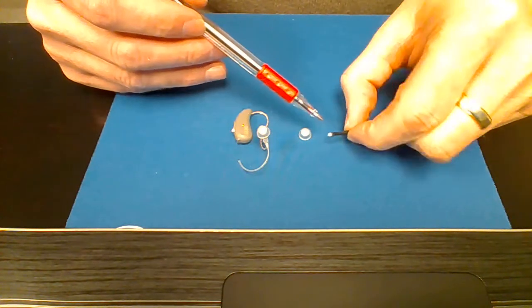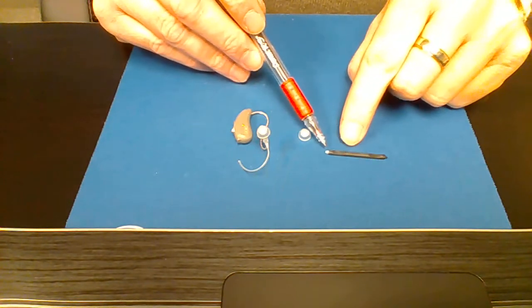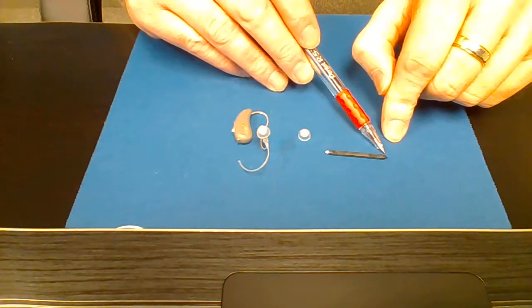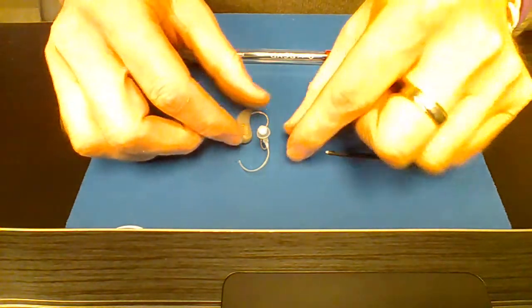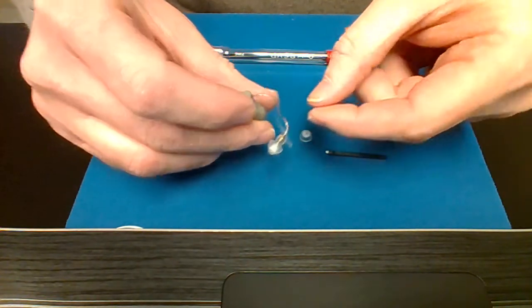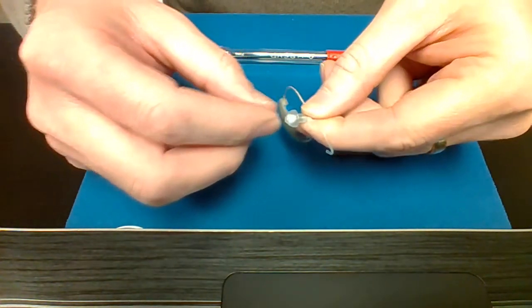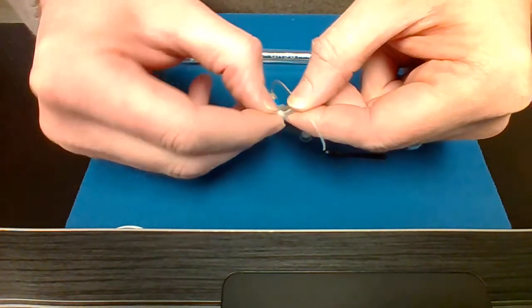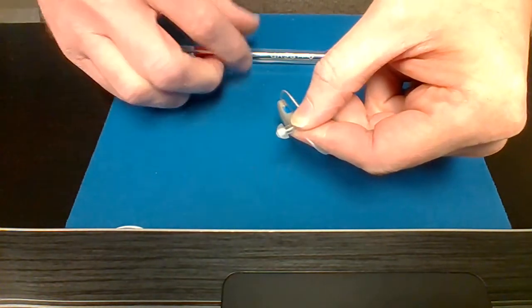This is a wax filter, and this is the replacement stick for it. It has a new wax filter on one end and a threaded end here for use with removal of the old filter. So the first thing you want to do is make sure that the hearing instrument is clean and doesn't have any debris around on the old dome, and make sure that's all cleaned off. And then you can just grab this dome and see this white part that's right here.